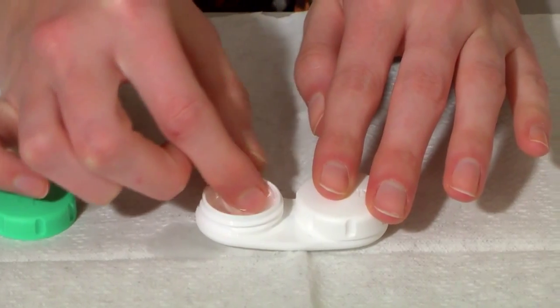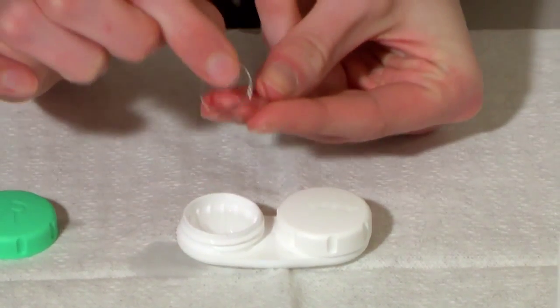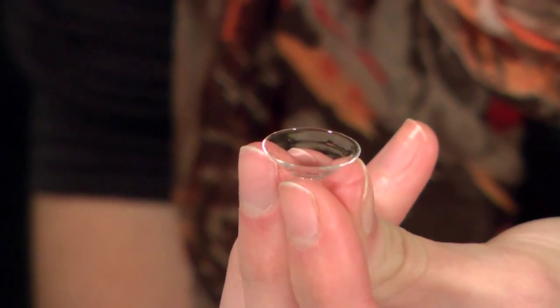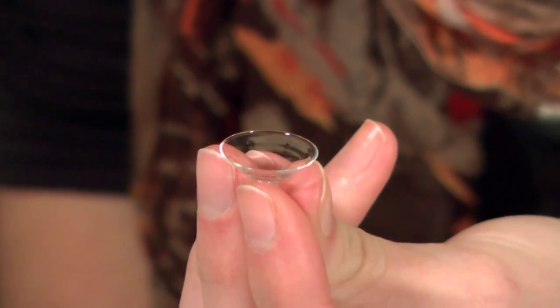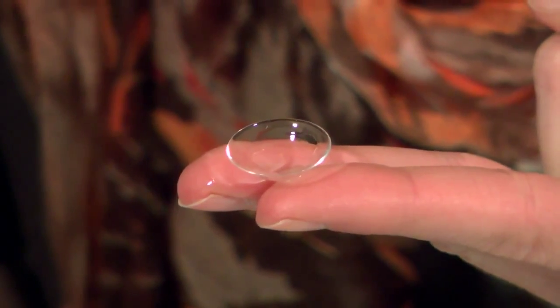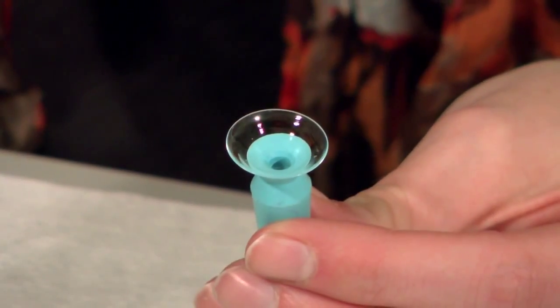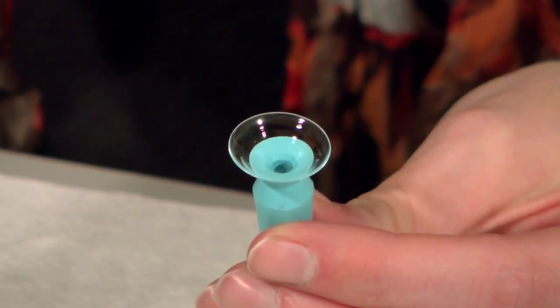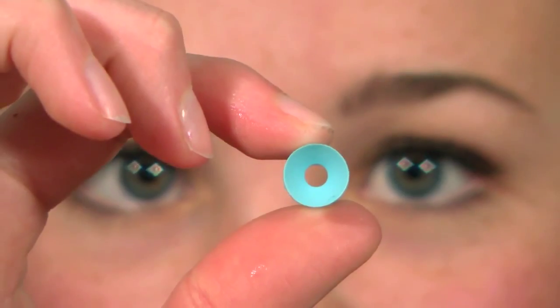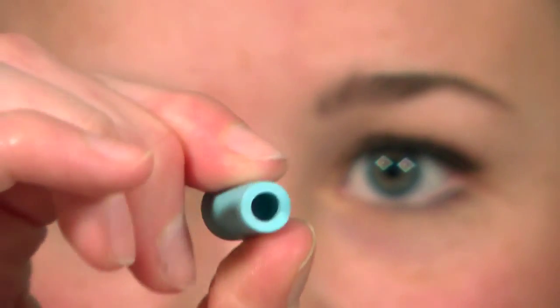There are several ways to hold a scleral lens for insertion; the technique used will depend on your personal preference. The most common ways are the tripod or three-finger hold, the two-finger hold, or the different DMV inserters. If your vision is poor, you may cut off the bottom of the DMV inserter with the hole so you can use the light from the hole as a guide when placing it on your eye.